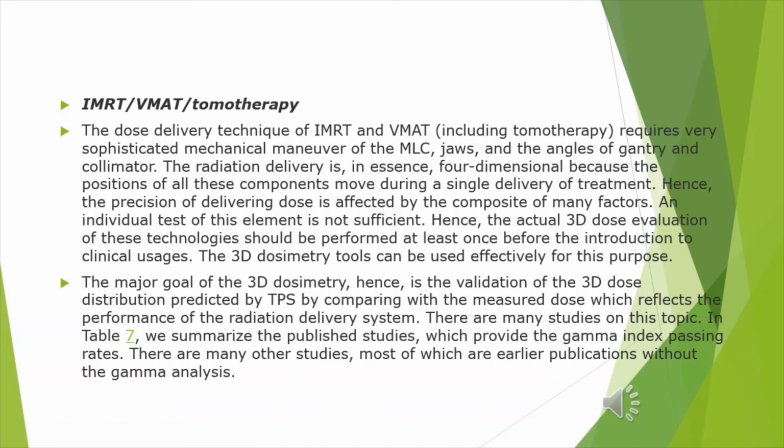The radiation delivery is in essence four-dimensional because the positions of all these components move during a single delivery of treatment. Hence, the precision of delivering dose is affected by the composite of many factors. An individual test of this element is not sufficient.